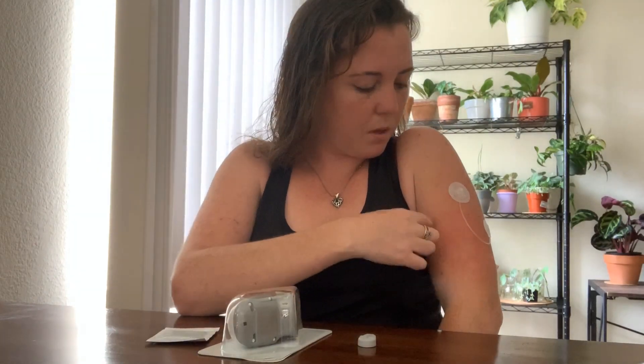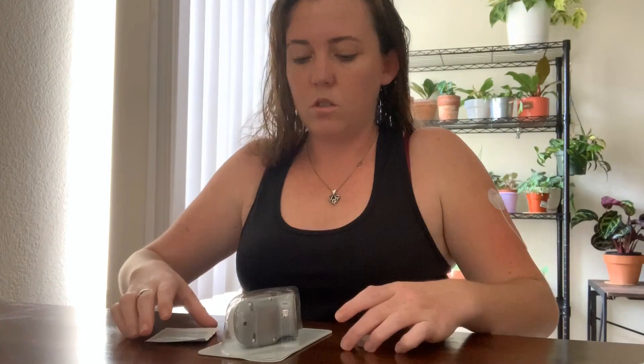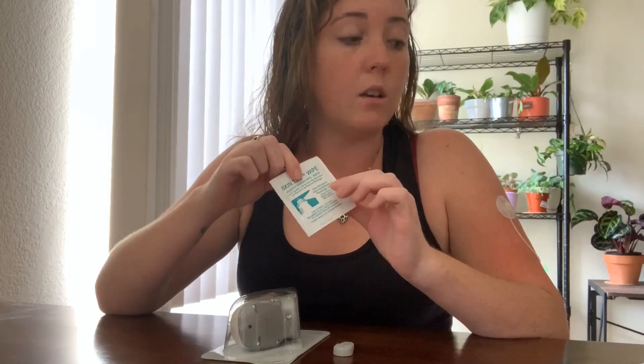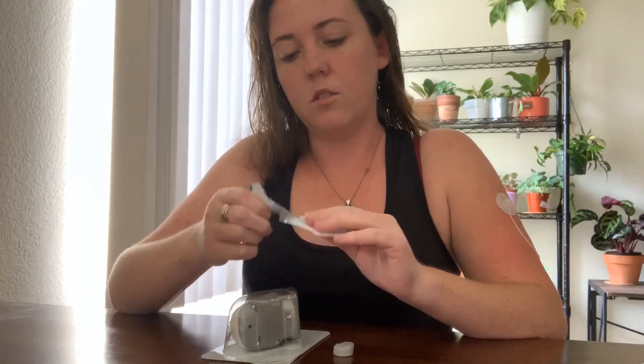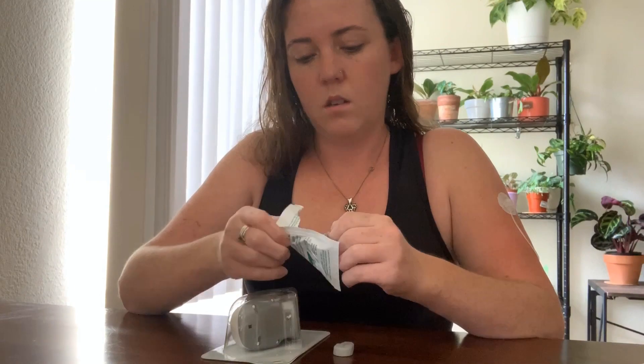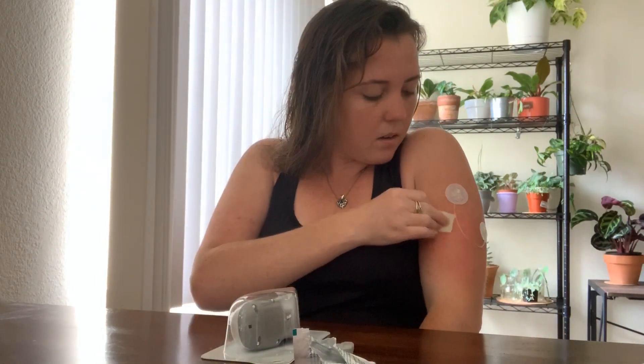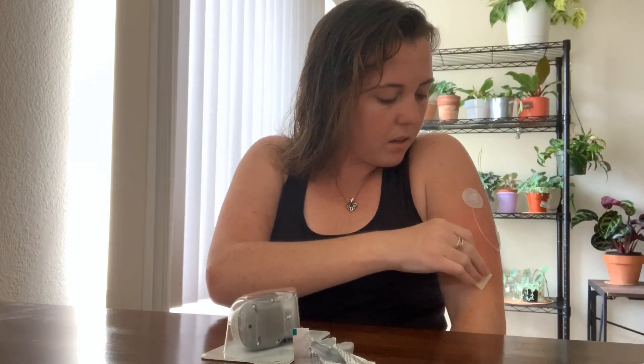The first thing I do is use these skin tac wipes — these things are amazing. It will stay on without an extra sticker for the entire ten days, sometimes double that time if I decide to keep it on longer. So I just go ahead and wipe the entire area.